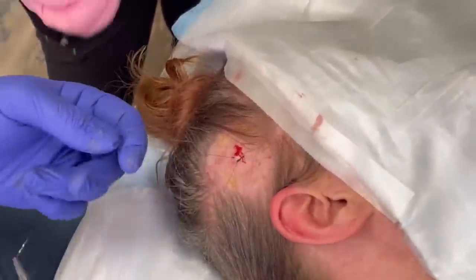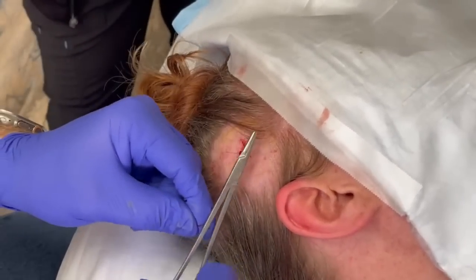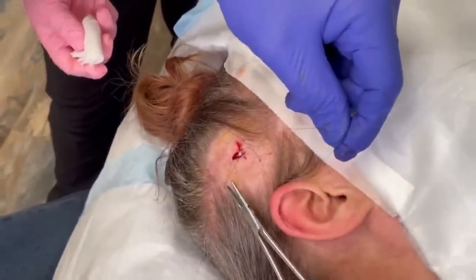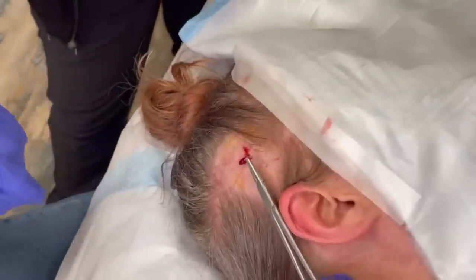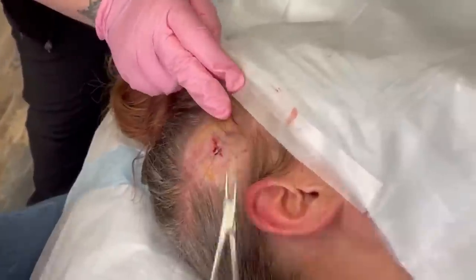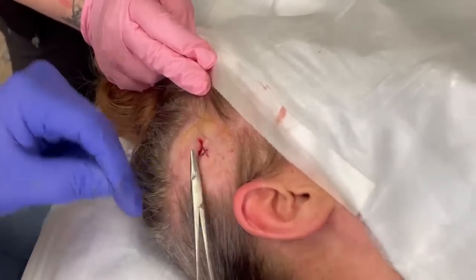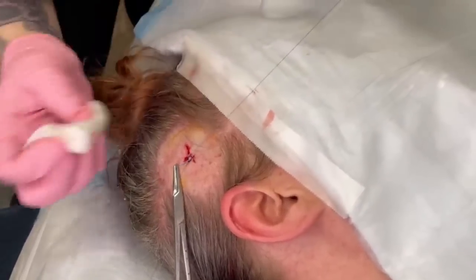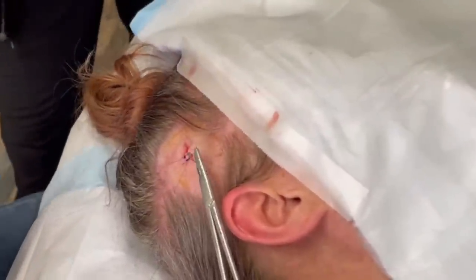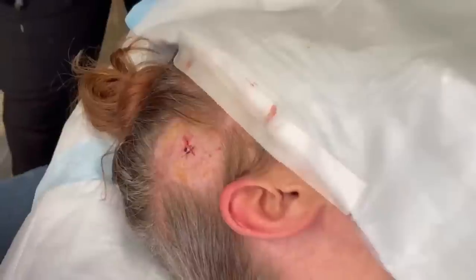All right. Second one now. I'm going to shorten that up so we don't get... That's better. That's all I needed to do right there. Shorten that up a wee bit. Good. Oh, I got a loop. There we go. Yeah, that little lock of hair right there. There we go. Thank you so much. You're welcome. And one more little tie. Good. You can cut that. All right. I think another stitch here.